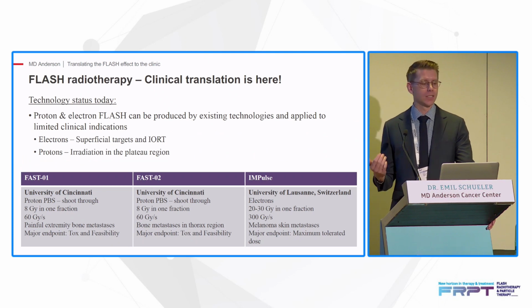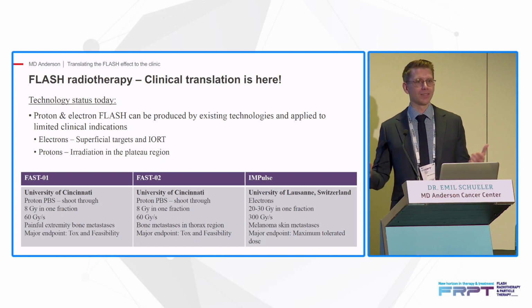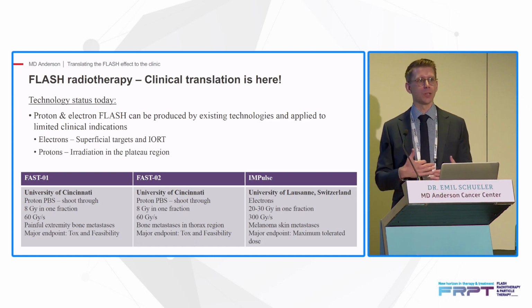We know that Flash radiotherapy, I think we all agree, clinical translation is here, whether you like it or not. And we do have the technology today to do this, both with protons and with electrons.